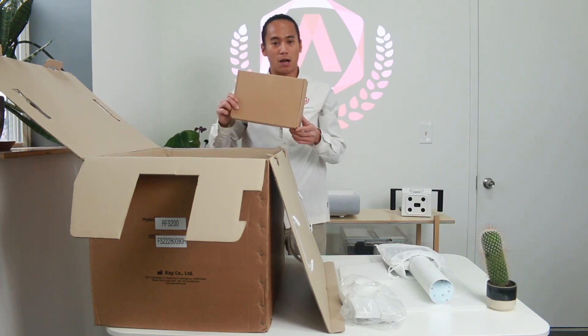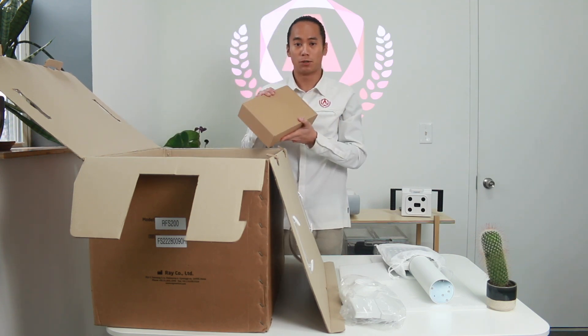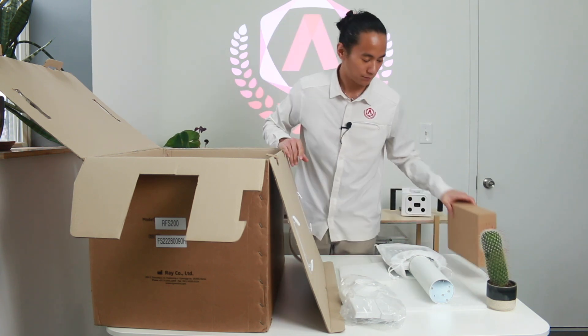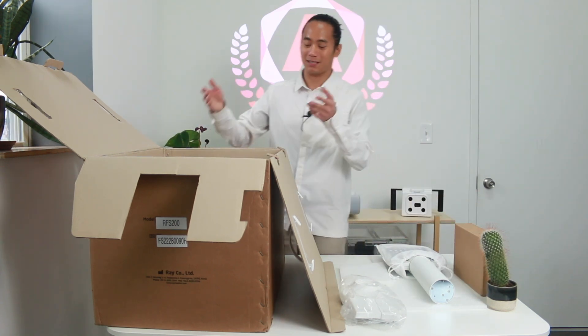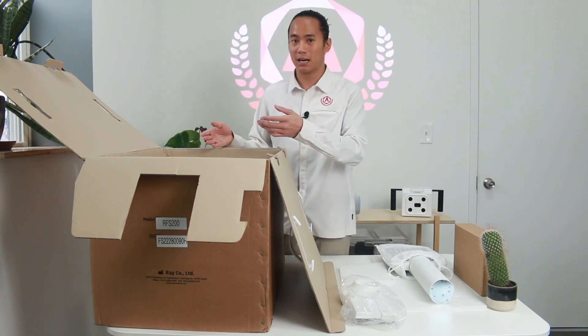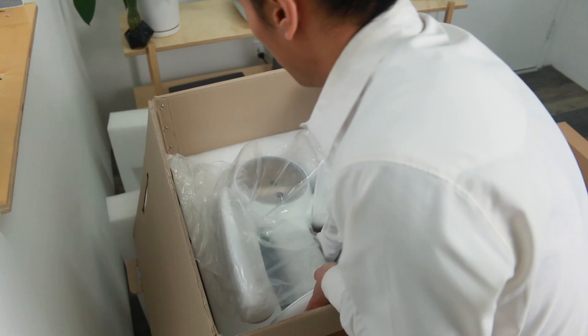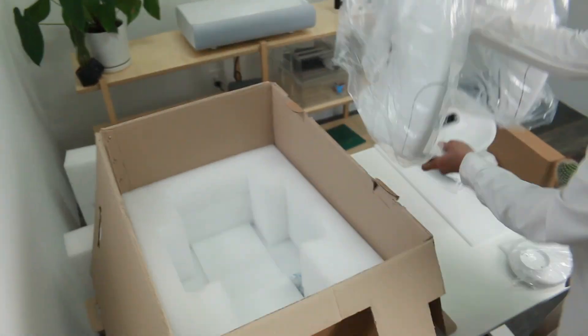This is your accessories box. This contains your power cable, USB cable, and Ethernet cable. The last thing in the box is the scanner itself. You want to be careful if you're going to be taking this out by yourself — grab it from the stand and the base and lift it out of the box.